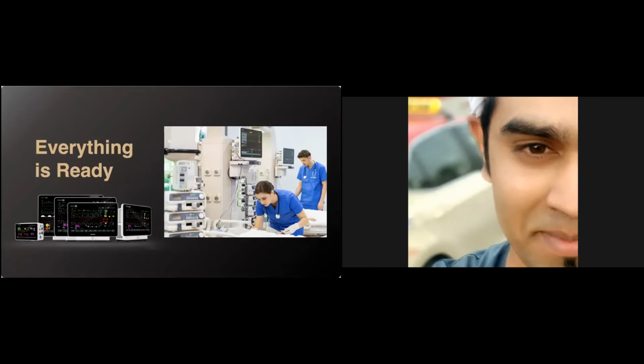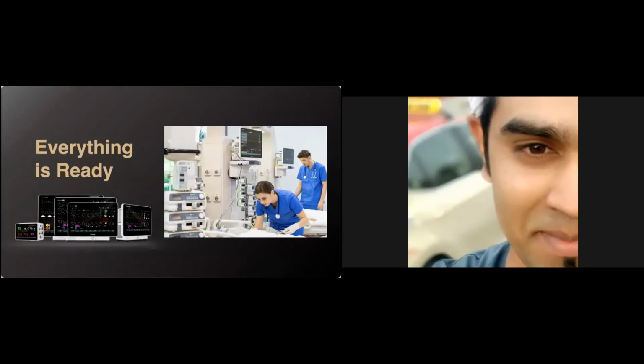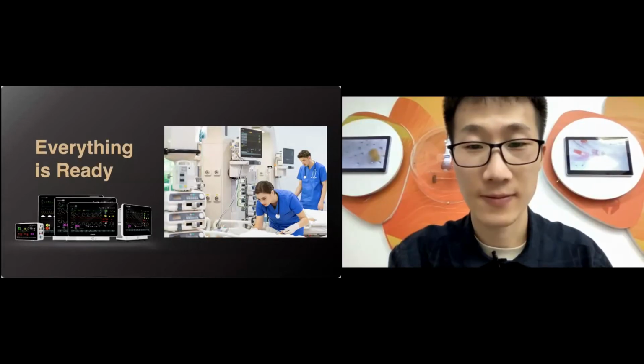Thank you. I just want to add a point for clarification, because of why I asked that: an integrated PC is basically when you add an extra window into the monitor. When a doctor wants to view PACS images, they can be viewed on it, so that's the reason I was asking you about that. Okay, so we do not have the possibility of a window that can be viewed, right? Yeah, not really for now. Okay, perfect. I just want to clarify that, because when a system has an option where I can say silence the alarm, then I think that should also be there. Yeah. Thank you.